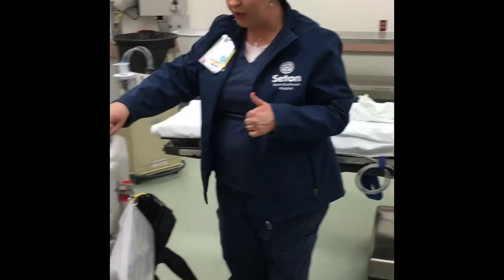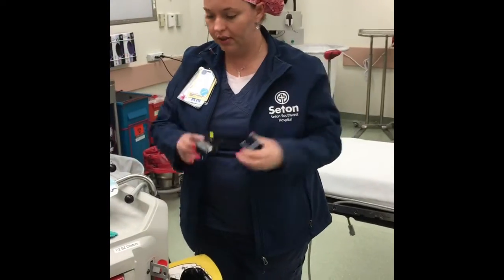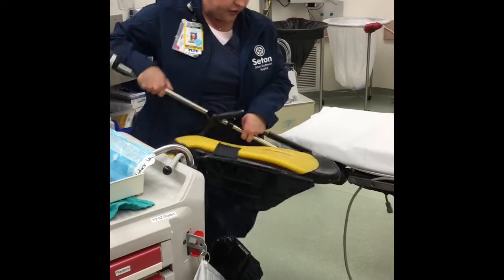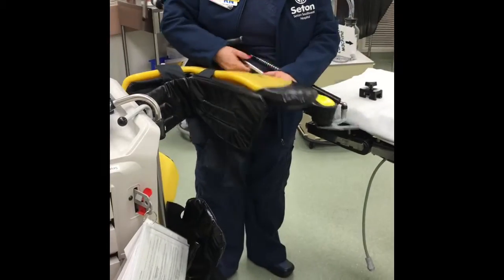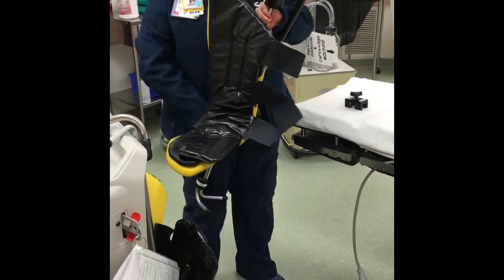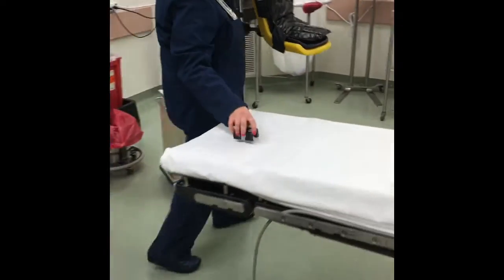So now I'm gonna start putting the stirrups on. So you need the clamps. That's the first thing that you need. And then you have to assess which goes which side, so which stirrup. So you want the inside of the stirrup to be the closest to the bed. So this one will go on the right side. So we'll come over to this side.